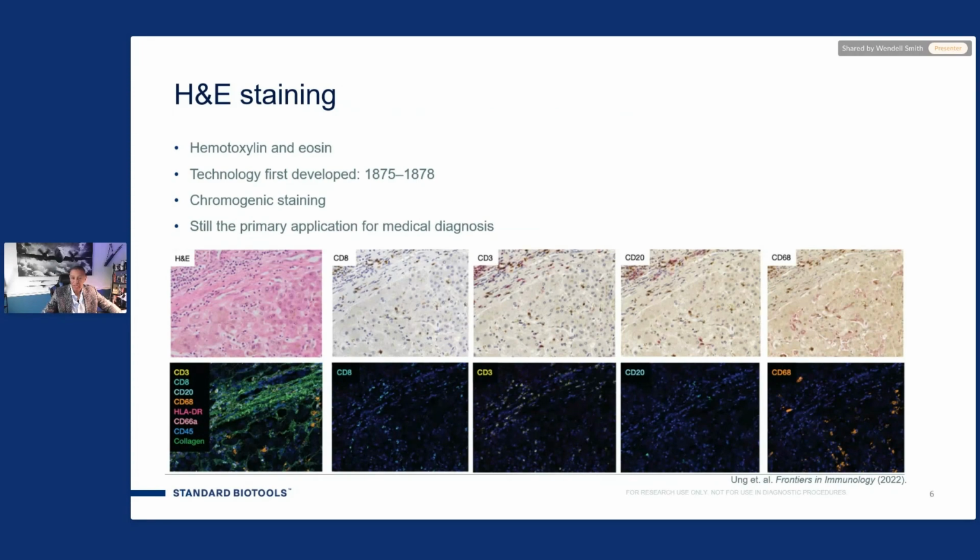So the idea is that you would use hematoxylin, right? So you get the ability to determine where your nuclei are with this purple stain, or you may use an acidic dye like eosin to sort of find the basic structures. And so you're looking at these shades of pink to red, and a pathologist has to come in and score that tissue. And while I'm not saying that we won't need pathologists, we will always need pathologists. More information is always better.